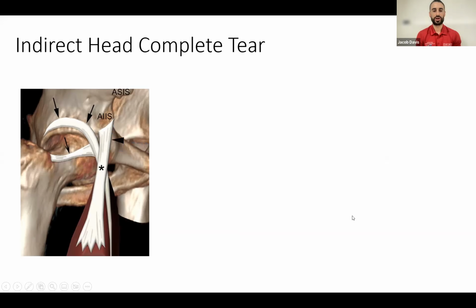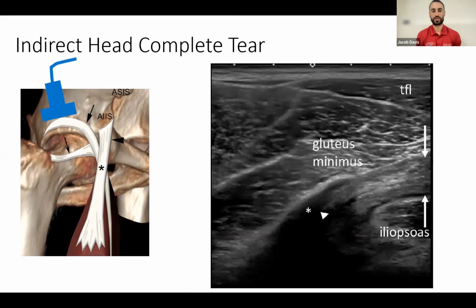Taking a look at the indirect head, which, as David mentioned, is a much harder image to get. It's a lot more lateral than you think. So I would recommend practicing getting this on multiple people to understand where this anatomy is.